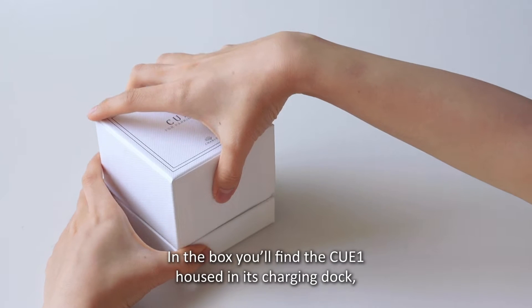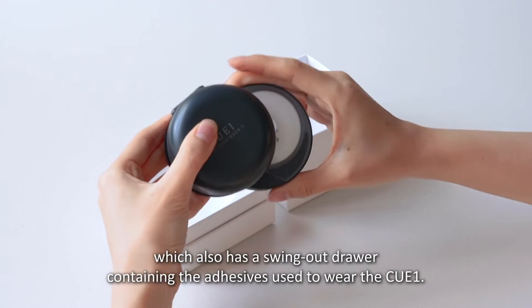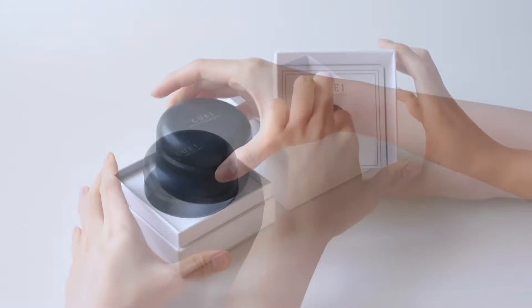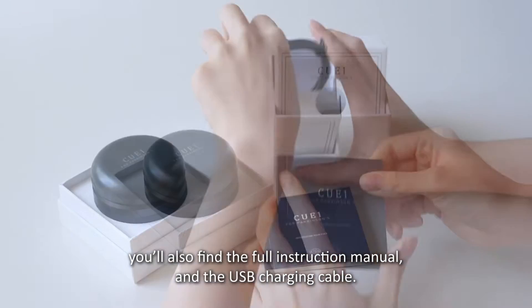In the box you'll find the CUE1 housed in its charging dock, which also has a swing-out drawer containing the adhesives used to wear the CUE1. In the lid of the box you'll also find the full instruction manual and the USB charging cable.